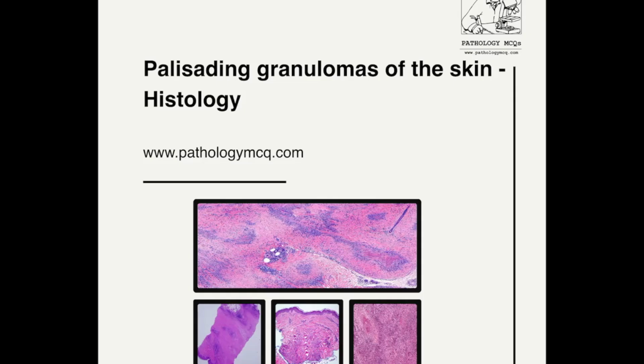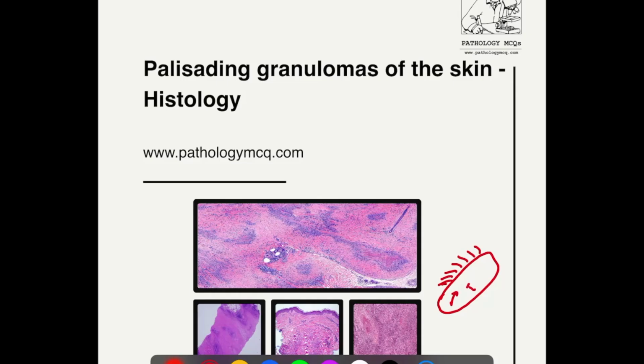These types of granulomas typically present with a histologic pattern where macrophages and giant cells are lined in a palisading pattern with a central area which is usually composed of degenerated collagenous material. This collagenous material may appear pink or blue due to the respective material depositions in these areas. For example, there might be fibrinoid necrosis associated.